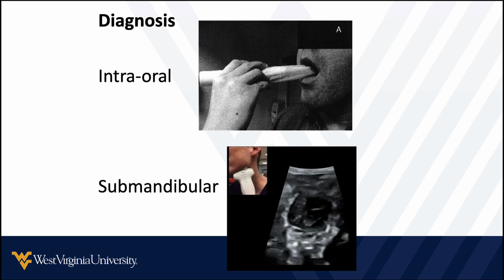But all right, so yeah, just quick recap. So we're not talking about this technique as much here today, but you can diagnose this using intraoral ultrasound, using the endocavitary probe, but specifically today talking about the submandibular technique using the linear or even the curvilinear probe under the mandible to help you identify this pus pocket here.